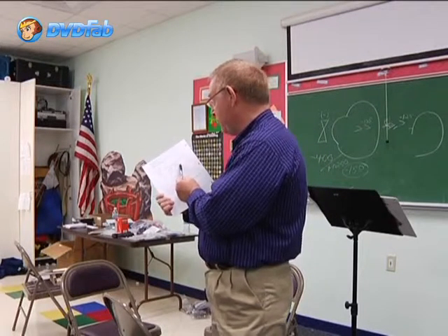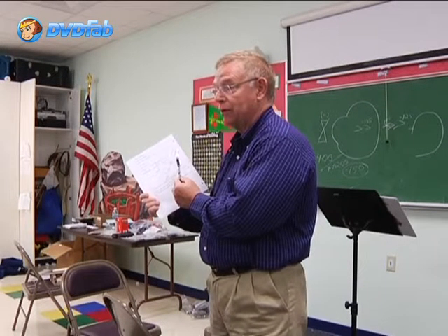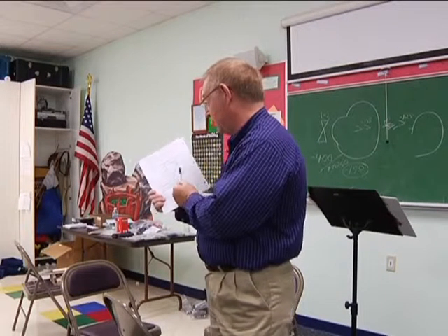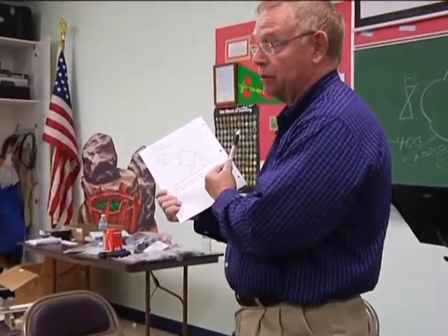If he chooses minus 1.75, compare minus 1.75 and minus 2. If he chooses minus 1.75, you are done. If he chooses minus 2, compare the 2 and 2.50. Keep increasing power in half diopter steps till the patient chooses the weaker power, and then you are done.